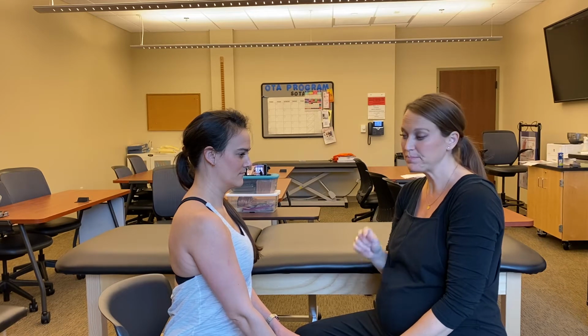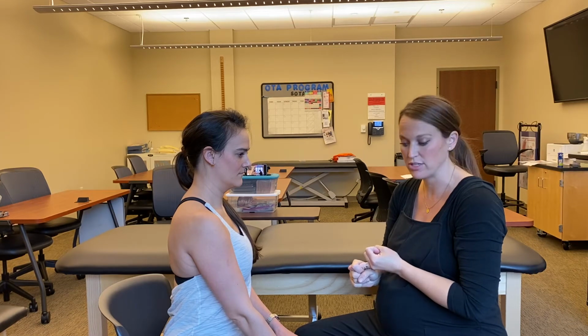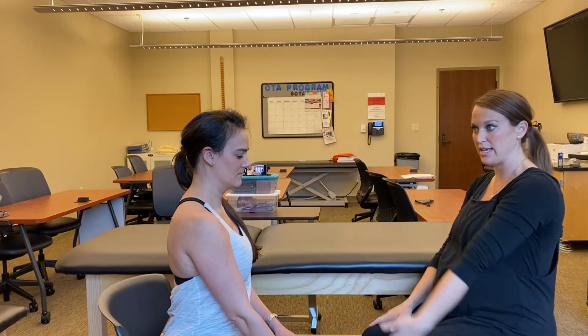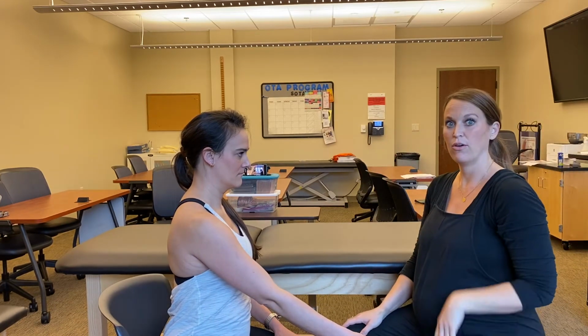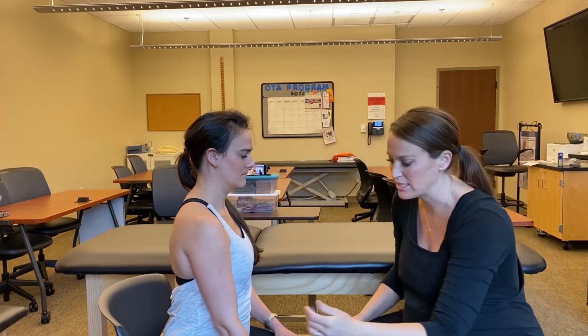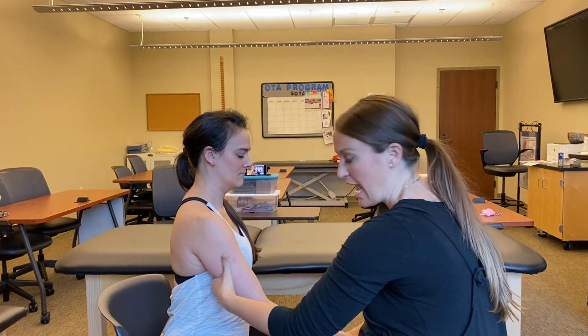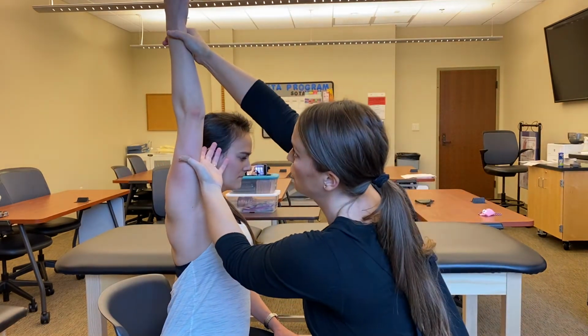Good. So we can see actively that she has greater than half of what's normal, right? So if your patient has greater than half active range of motion, you're gonna measure it, and then you're gonna go straight to manual muscle testing. However, if I say to do this, and Courtney goes to here actively, then I need to see what her range of motion is passively. So I'm gonna support the limb, both proximally and distally, and I'm gonna bring her through range of motion.